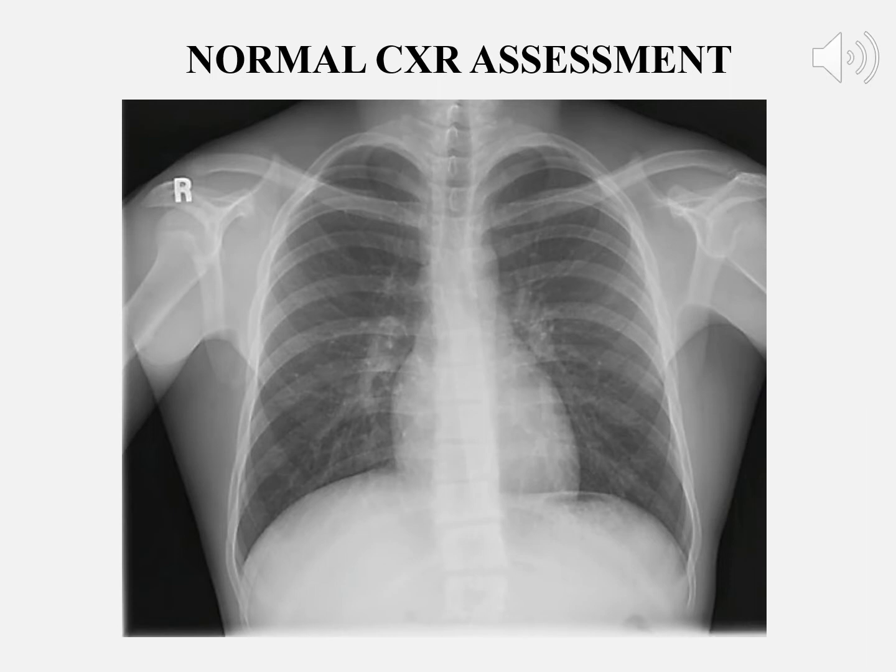So as we get into chest X-ray assessment, I want you guys to be aware of some things. Number one, regardless of the purpose of viewing a chest X-ray, whether you're doing a screening exam prior to a procedure, whether you were checking placement of catheters and tubes, when you look at it and you view an X-ray, you are interpreting it, and you are responsible for everything that is on that image. You're responsible for knowing what everything is on that image. And you are responsible for assessing and relaying that information on.